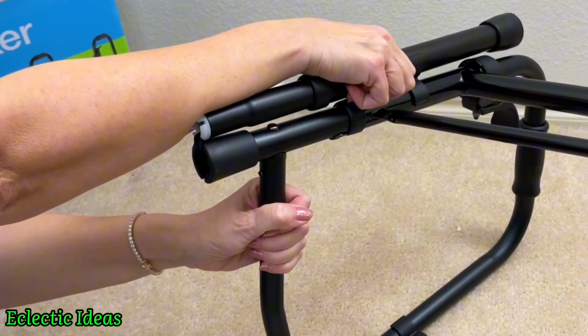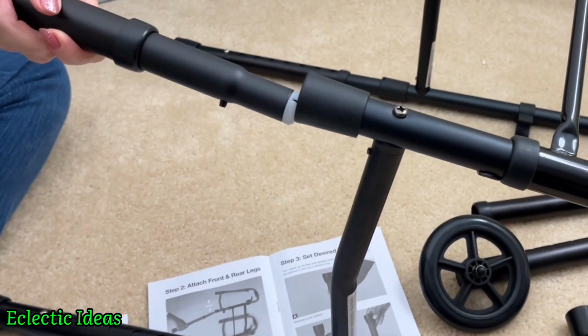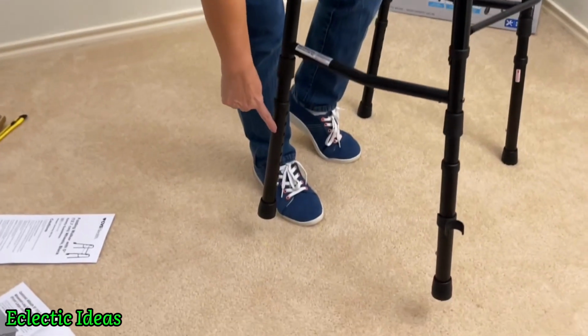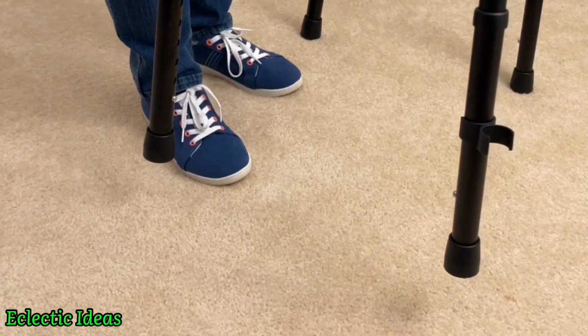Here we go. Now that you've got the drill, keep going all around the mulberry bush until you get every leg in. And now we're on our last leg, literally. And we're taking it up a notch right here. Now that we've got the legs in, we can actually adjust the height right here at these lower legs by simply changing which notch they're in. And we have yet to put on the wheels.